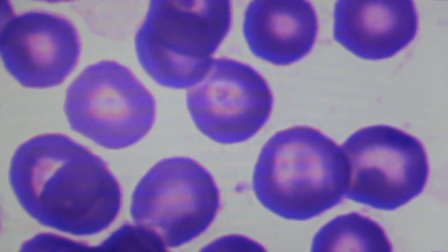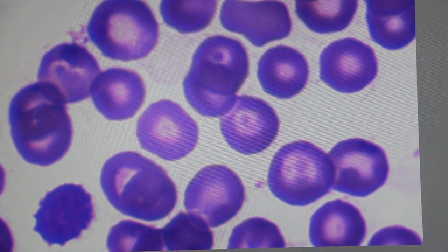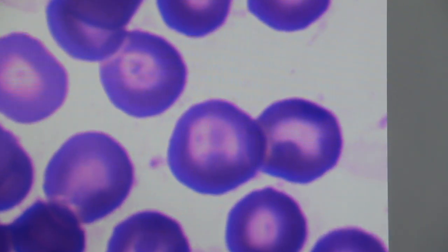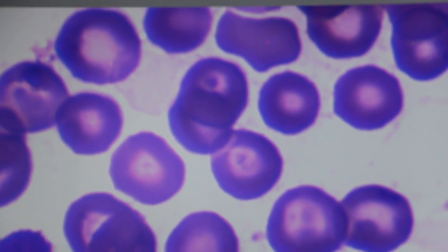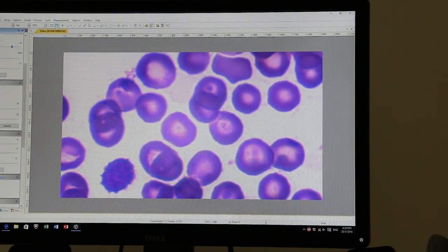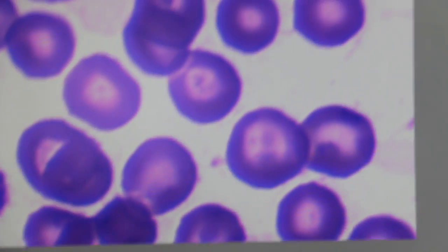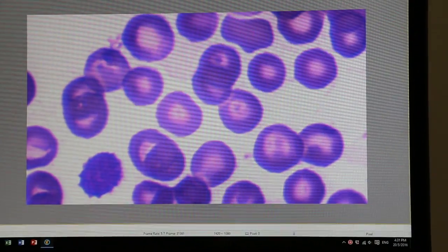But the dog came to Toa Payoh Vets about 10 days later, and we found that there was Babesia canis in the red blood cells. As you can see, you can see the parasites inside the red blood cells, and with an injection of Imizol, the dog appeared to respond very well and is eating now.